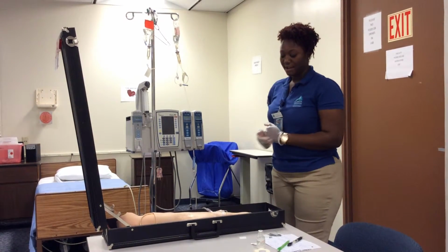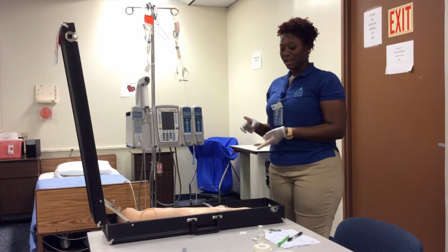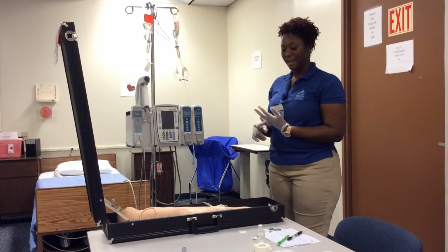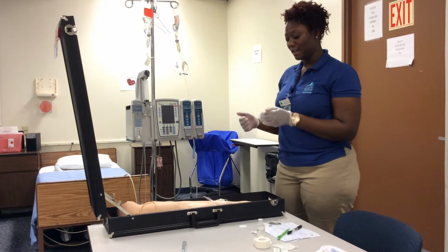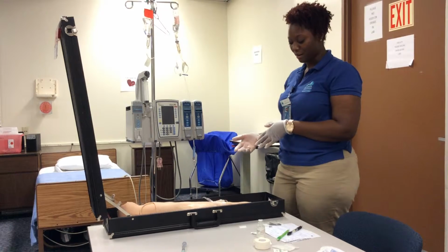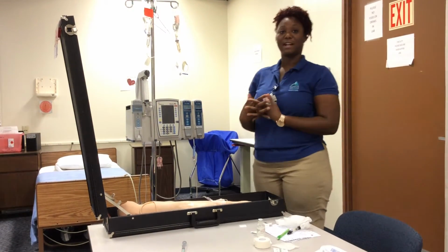So before I leave, I need to check my 4 Ps. Make sure the patient is in a good position, see if they need to use the restroom, check for any pain, and if they have their personal belongings. And again, to call me if you're having any swelling, any leaking, or any pain in the arm. So next, I remove my gloves, wash my hands, and now I'm ready for documentation.